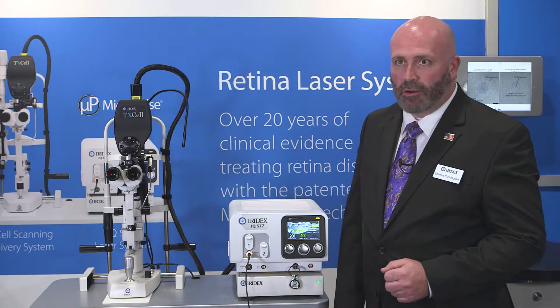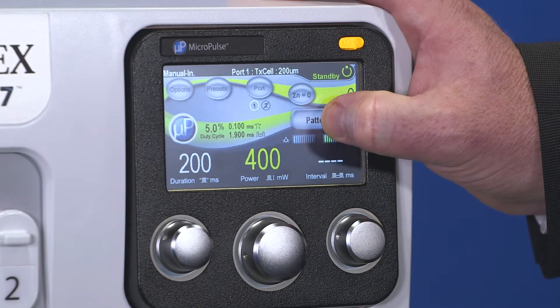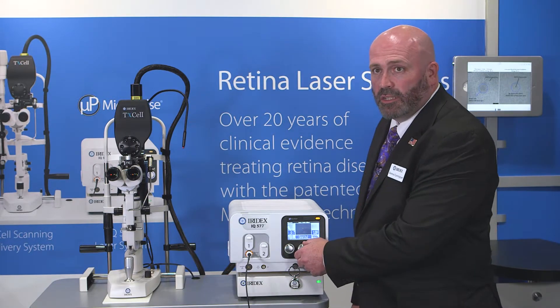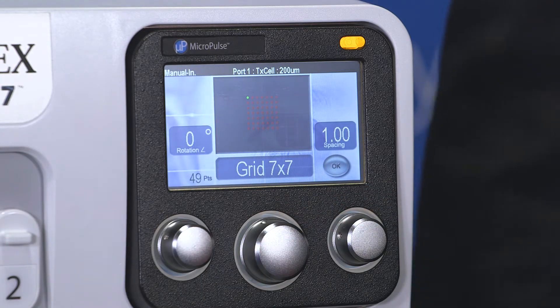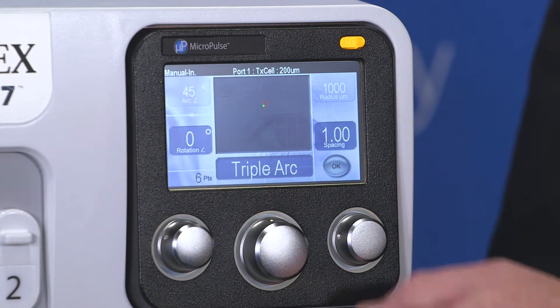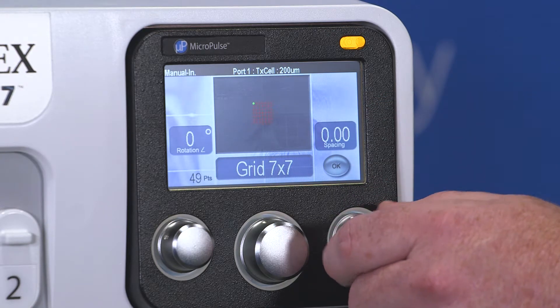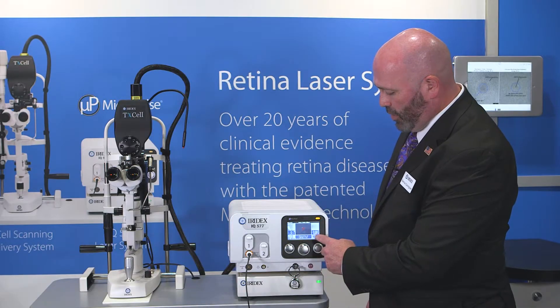To select a pattern on the IQ577, you'll press the pattern icon located above the interval dial. This will allow you to select from grids sizes 2x2 all the way up to 7x7, a triple arc, or a circle. For our MicroPulse Focal, we'll be using a 7x7 grid. You can also adjust the spacing by rotating the dial underneath the spacing, and press OK.